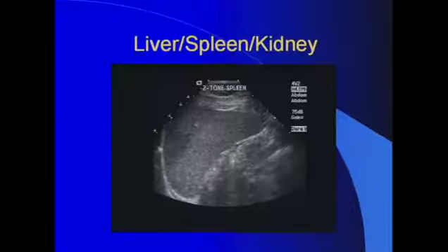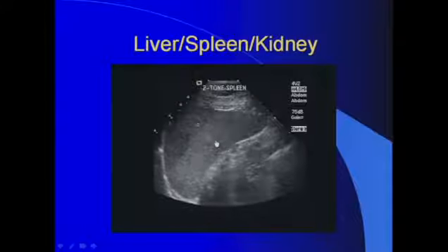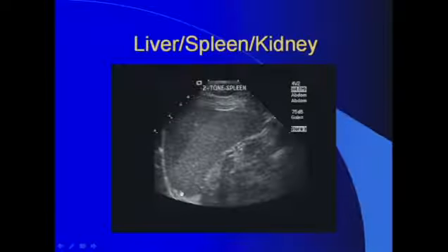So let's look at this video clip and understand the difference between the echogenicity of the kidney, spleen, and the liver. You can see here that in some individuals, when you're scanning the spleen with the patient in the decubitus view, right side down, sometimes the left lobe of the liver can migrate all the way to the left side of the abdomen and reach the spleen. This is what I call a kissing spleen liver sign.